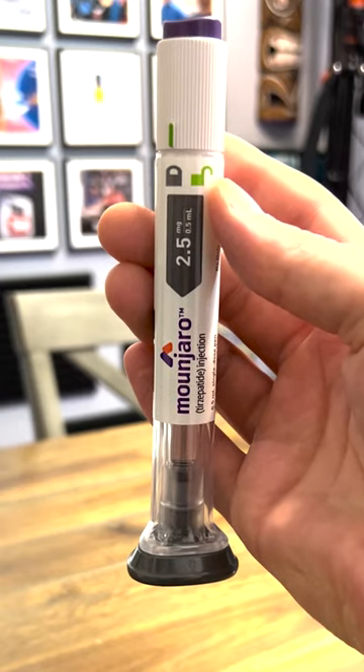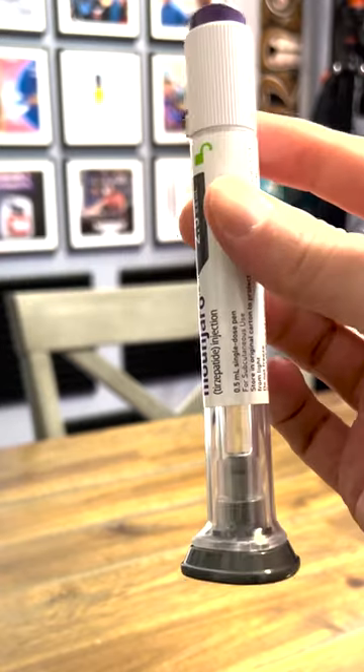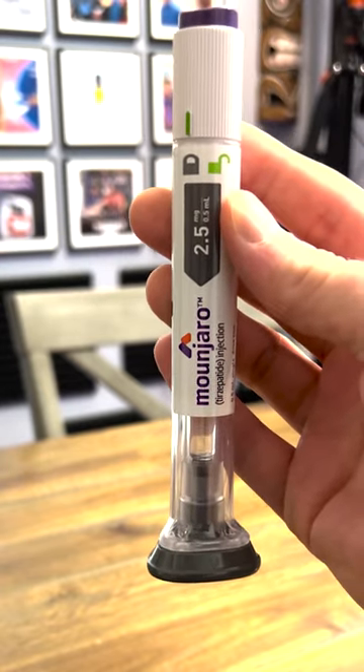What's up guys? I'm going to show you how to use Mounjaro. It's the same pen that's in Trulicity, so most of you are going to be familiar with this, but I'll give you an example.